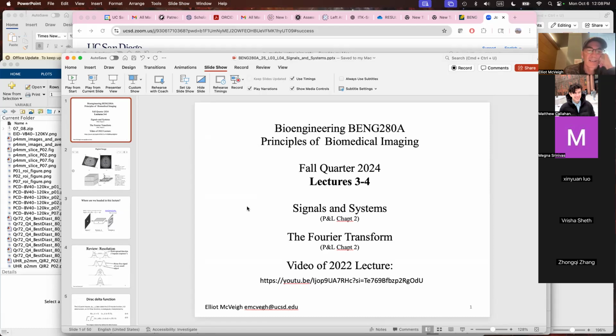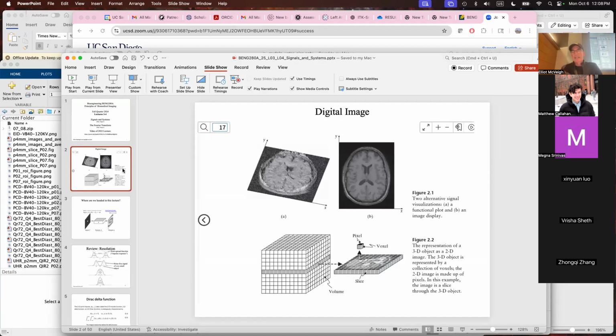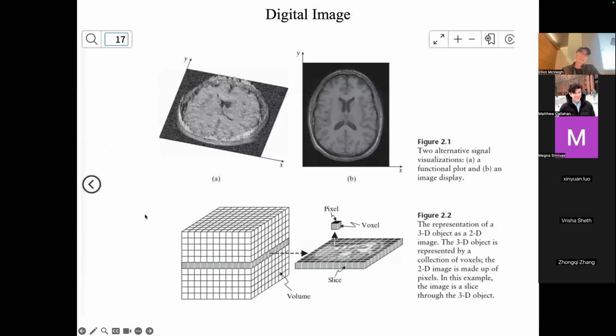Okay, great. So now we're going to look at how we mathematically describe pictures, which will help us write down how you make a CT image. This is our picture, an example of one. This is a 2-dimensional picture. I have X and Y here. Each point on here, I could have 256 by 256 points, has a different brightness, and we make this picture.